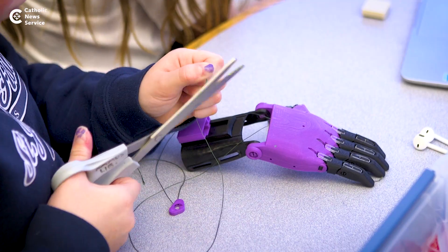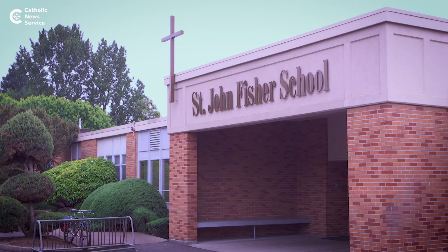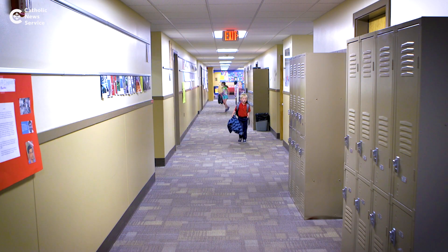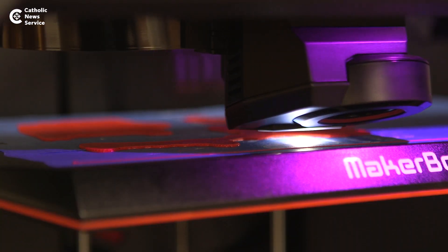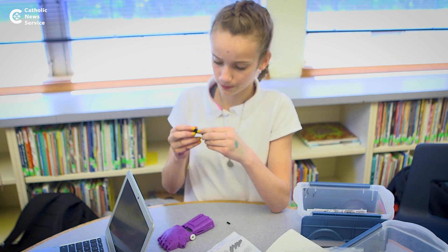It's a 3D printed hand that we printed that can allow people to basically have two hands. Our Makerspace Club has linked with Enabling the Future to help provide opportunities for students in our middle school to actually create functional prosthetic hands for children.